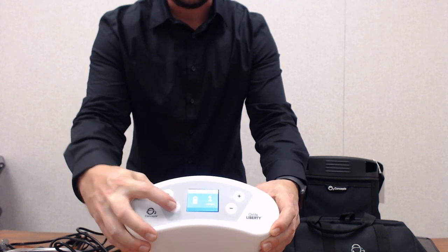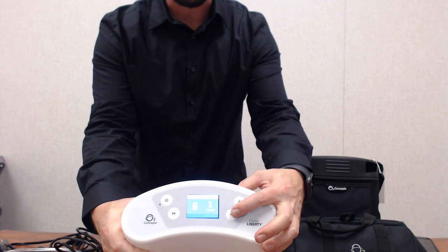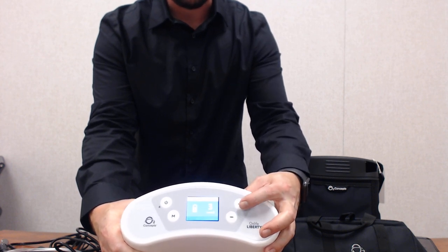To go to pulse dose, hit the mode button and select the pulse option. Use the plus or minus to go up or down — pulse dose ranges from one through nine liters per minute.